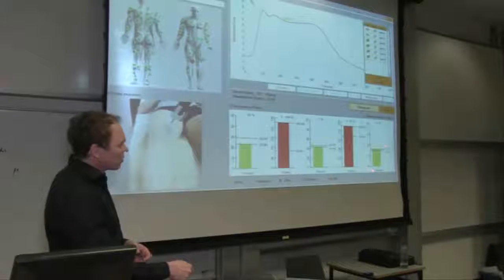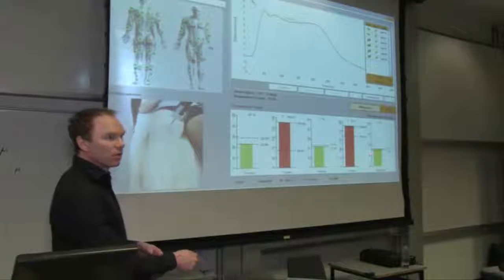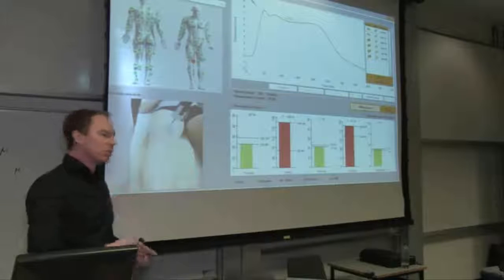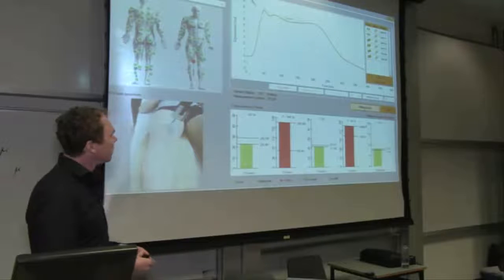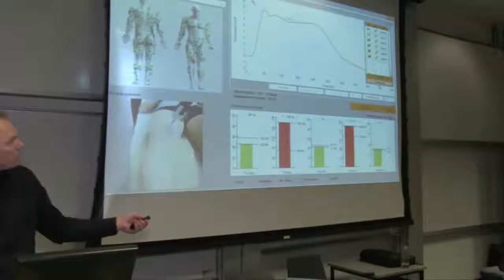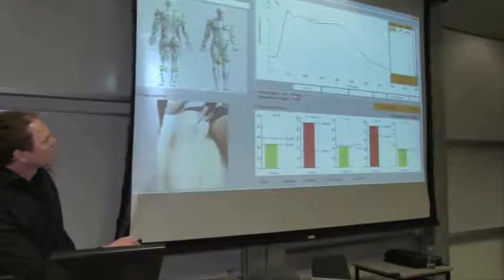And then when I look at displacement, it is a slight difference, 8% from the normal or the average value, but it's within the normal range. So it's not too stiff, it's not too loose. So from that point of view, I would say good tonus, very good speed. Nice result. So I will keep the last measurement. I click Save Last here, and all the other measurements before with the lower amplitude are deleted, and I'm left with this.